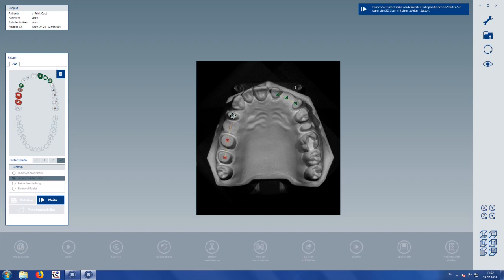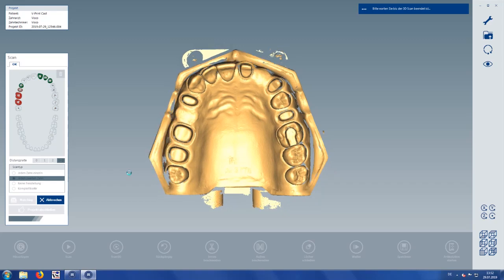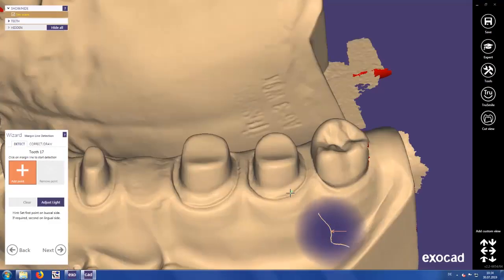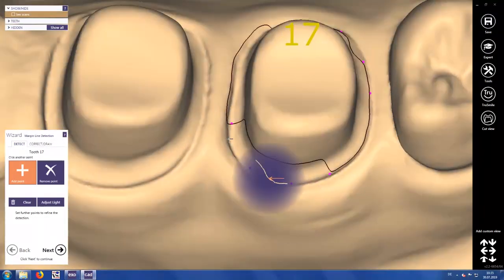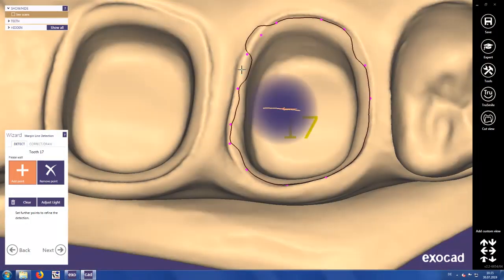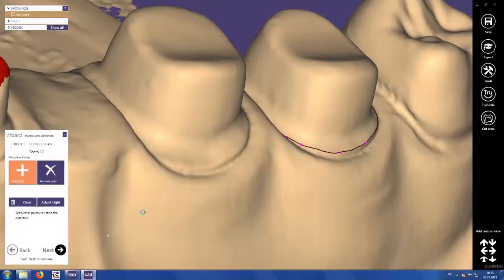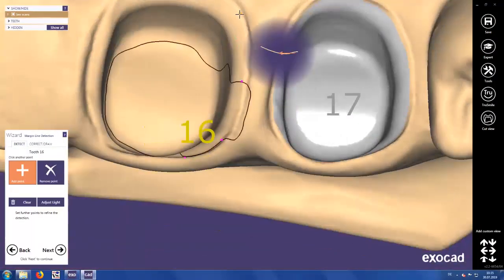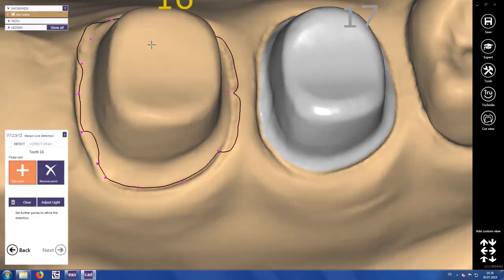In the software, we first receive an image on which we determine the teeth on which the restorations are located. The software then shows us the digital 3D model. This model is then used to define the preparation margins. The dental technician relies on experience to determine how long the crowns should be. The software marks these areas in gray and thus defines the working areas.